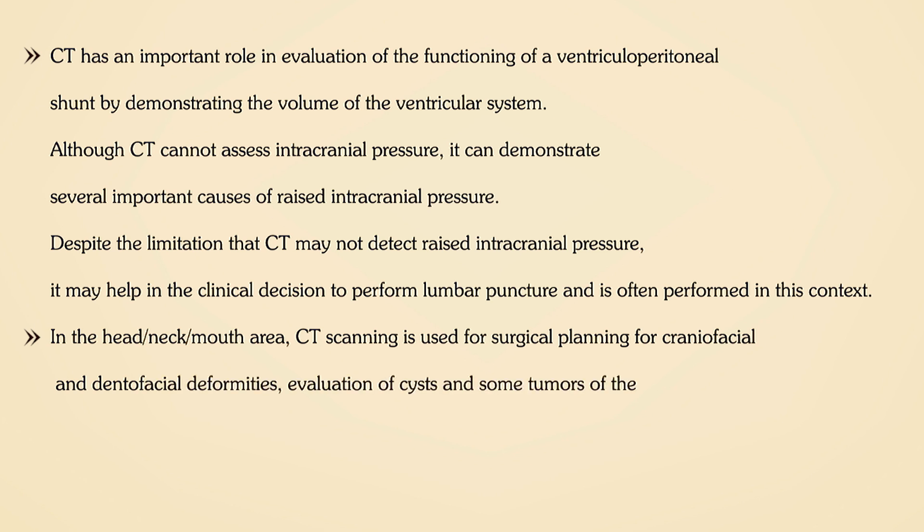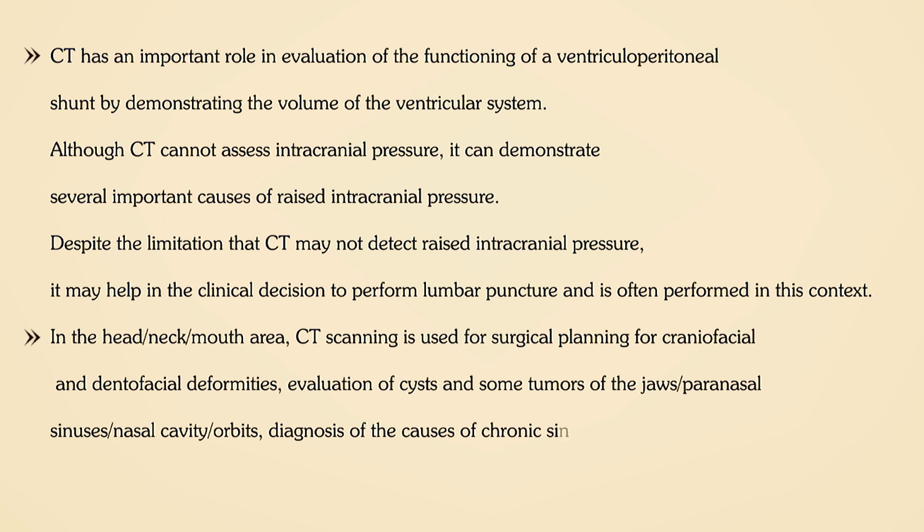In the head, neck and mouth, CT scanning is used for surgical planning for craniofacial and dentofacial deformities, evaluation of cysts and some tumors of the jaws, paranasal sinuses, nasal cavity, orbits, diagnosis of the causes of chronic sinusitis and for planning of dental implant reconstruction.